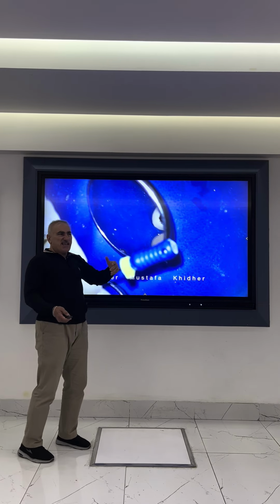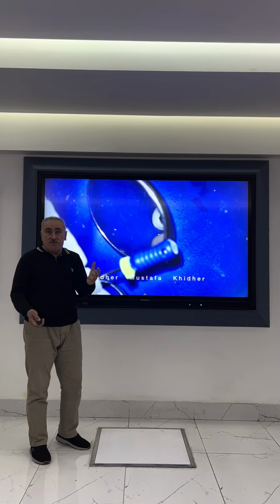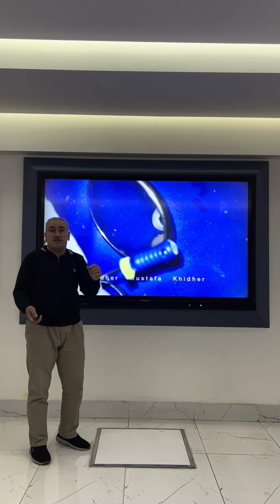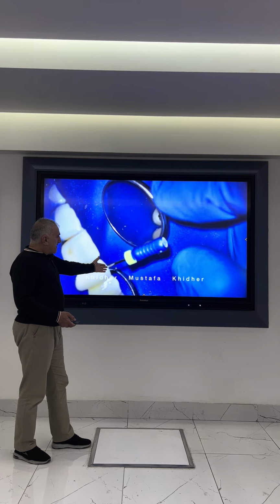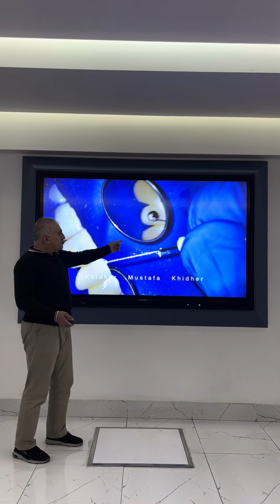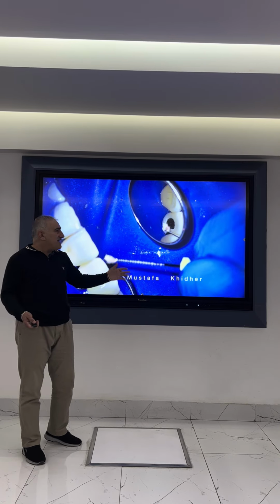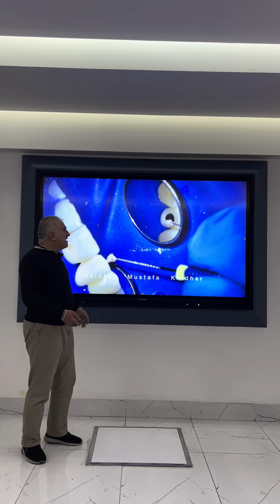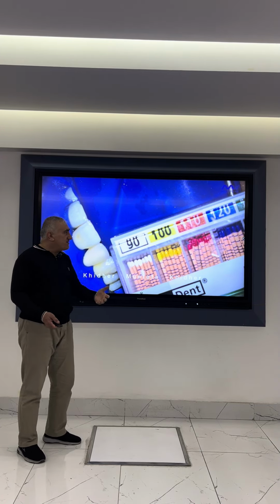I think it acts like a sequestrum formed inside the lesion. For this reason it didn't heal, and besides that, there is bacteria inside. So I just use an H-file to remove the cotton. Really, I'm very relaxed because I know there was something inside the canal which is a foreign body. I remove it. Again, more disinfection and activation of irrigation is important.